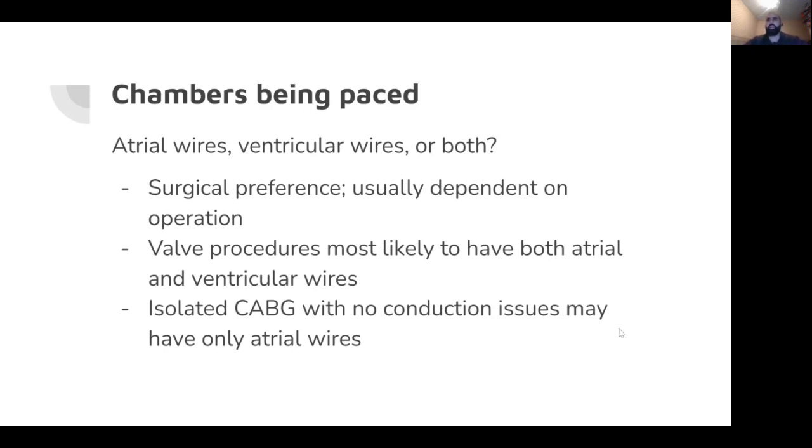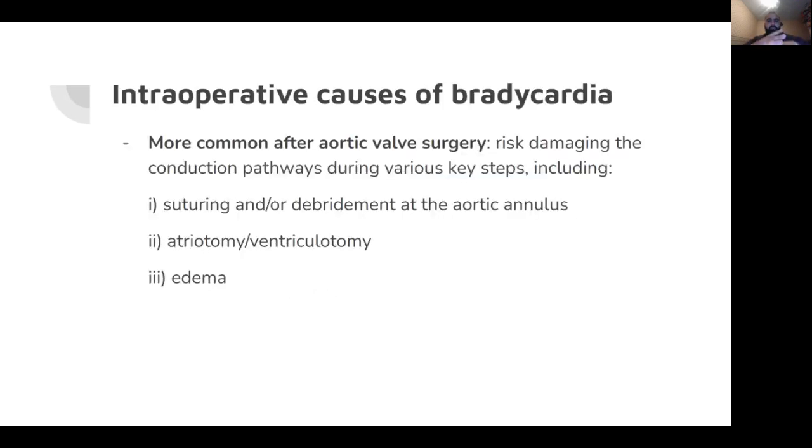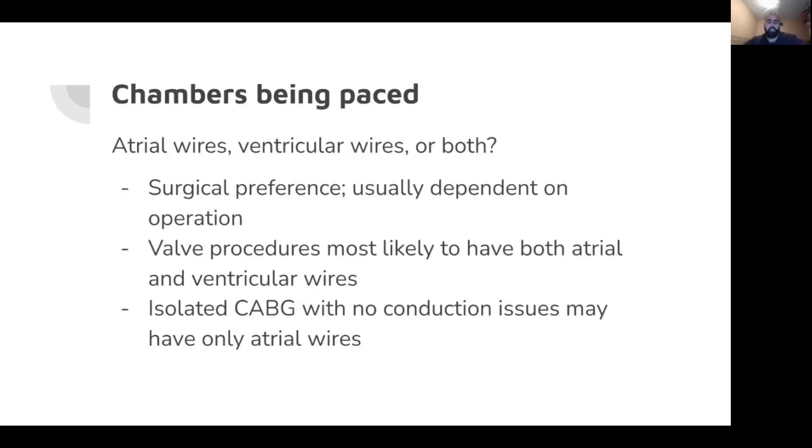And the reason you may ask, why don't you just always do both to be safe? I suppose the answer is, as with anything in medicine, do no harm first. There's always risks associated with everything. When you put pacing wires in, 3, 4, 5 days later, you have to take them out. And there's always a risk that when you take the pacing wire out, there could be a small amount of bleeding from the area, which could build up and cause some compression on the heart. This does happen sometimes. So with everything, you have to weigh up the risks and benefits.